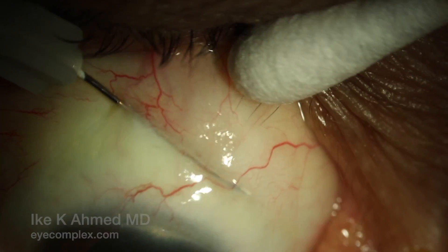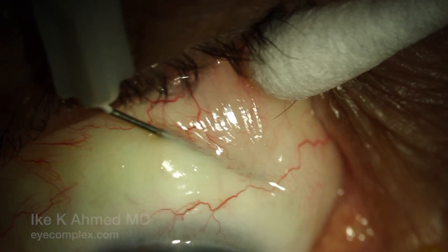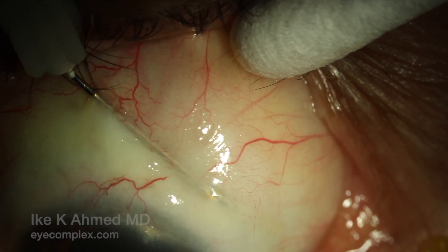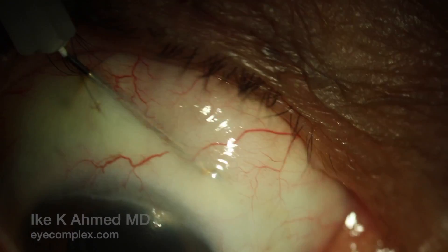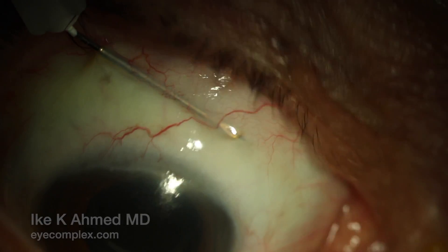The needle bevel is placed under the implant carefully and slid under the implant, and then the needle is swept toward the fornix. The slide and sweep technique is used to cut fibrotic tissue around the implant.